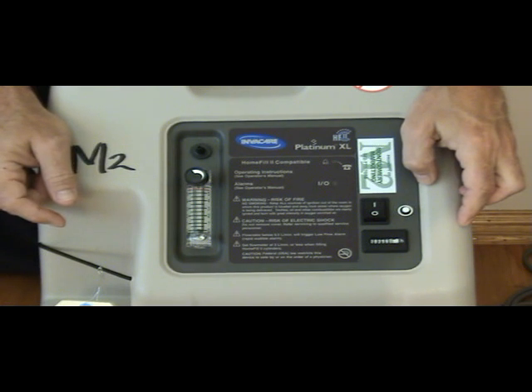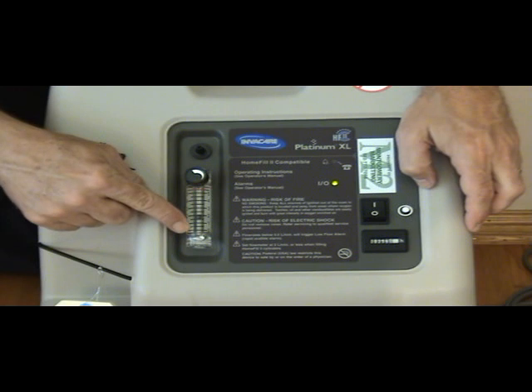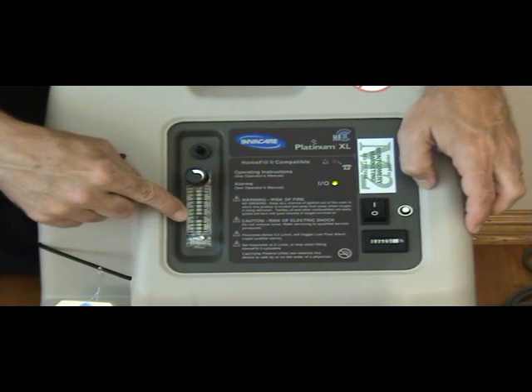That beeping was the alarm. That's what you will hear also if there's a power outage or a power surge. Okay, so we've moved it to the on position, and you see that the ball has started to rise inside the flow meter.